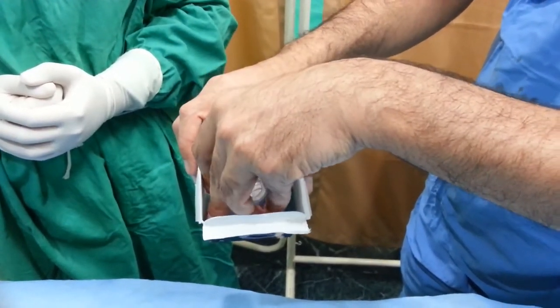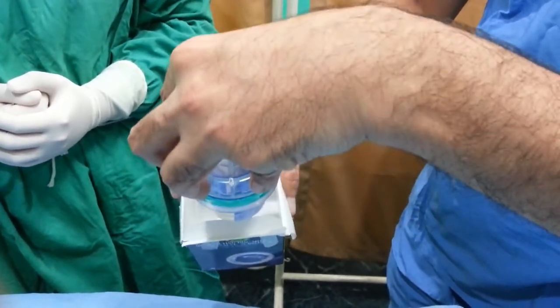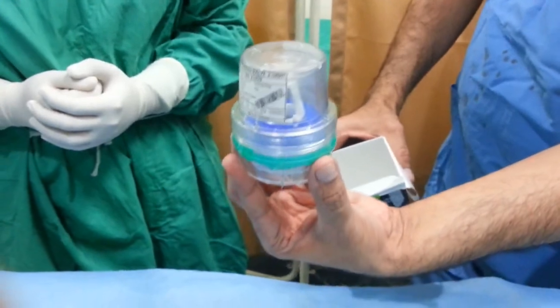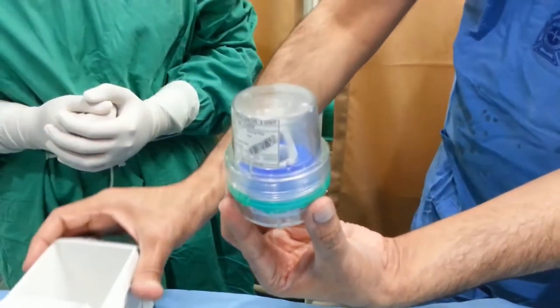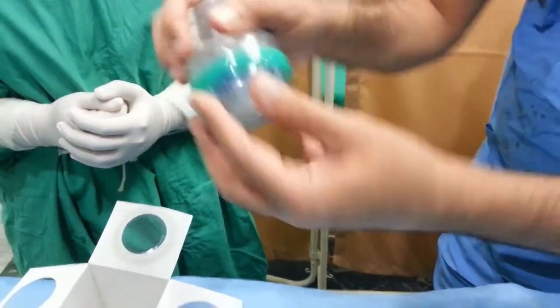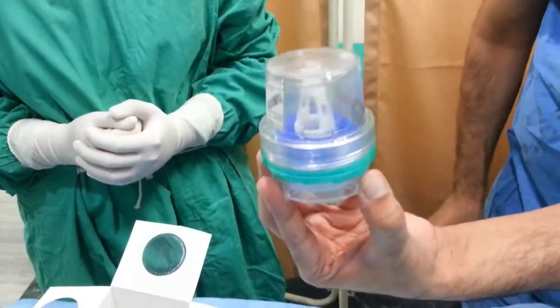It should be with the left hand, so that this valve is made like this, so it presents like this. Pick it up and invert it. It's important to invert the valve, because the valve box is designed in such a way to present the valve to the nurse. Remember, when you hold it like this, don't play around. Keep holding it. Don't turn it around. Keep it in the same position.